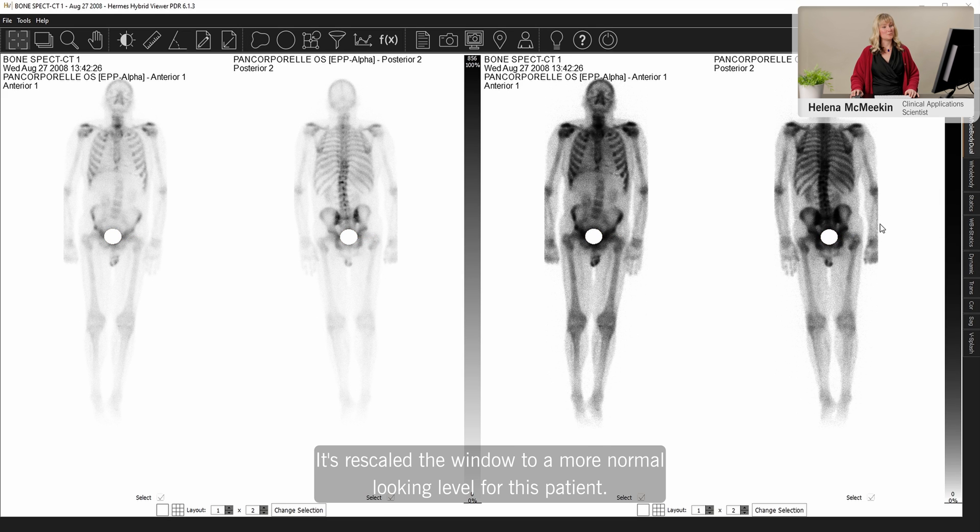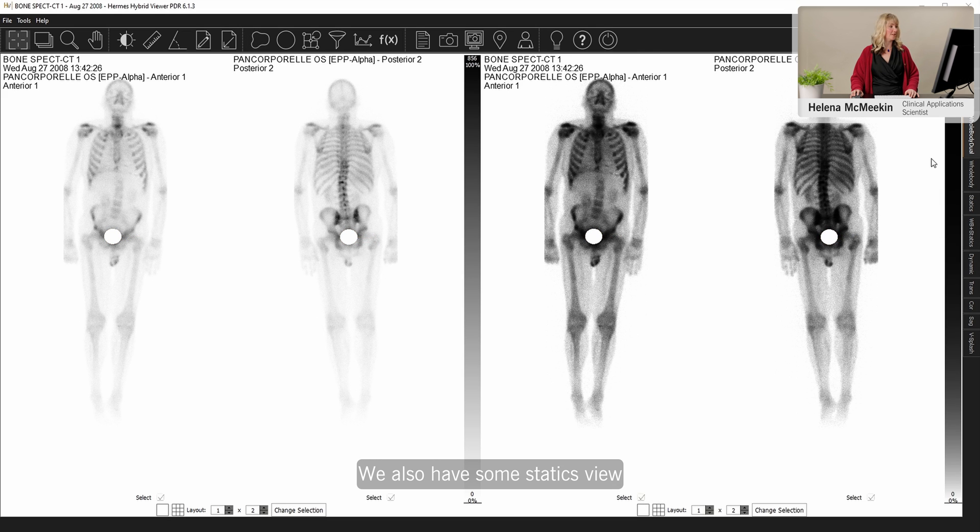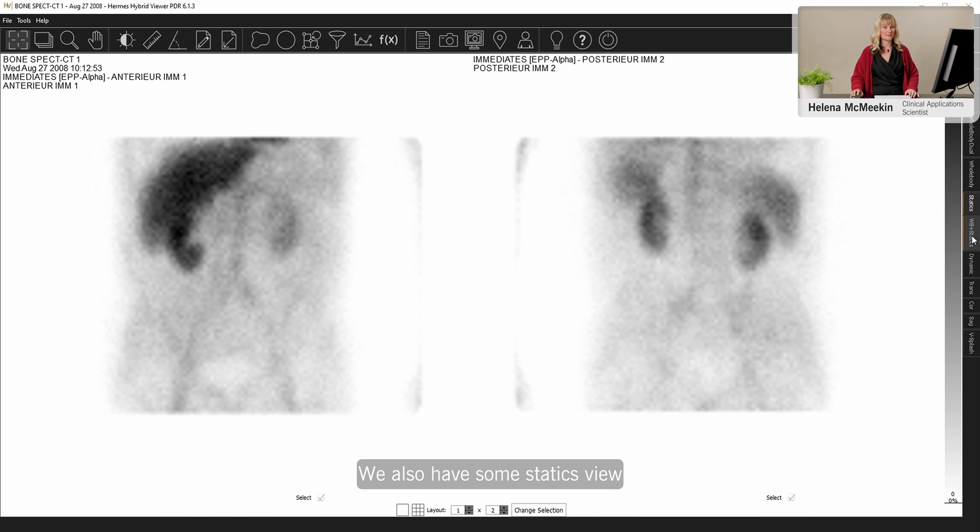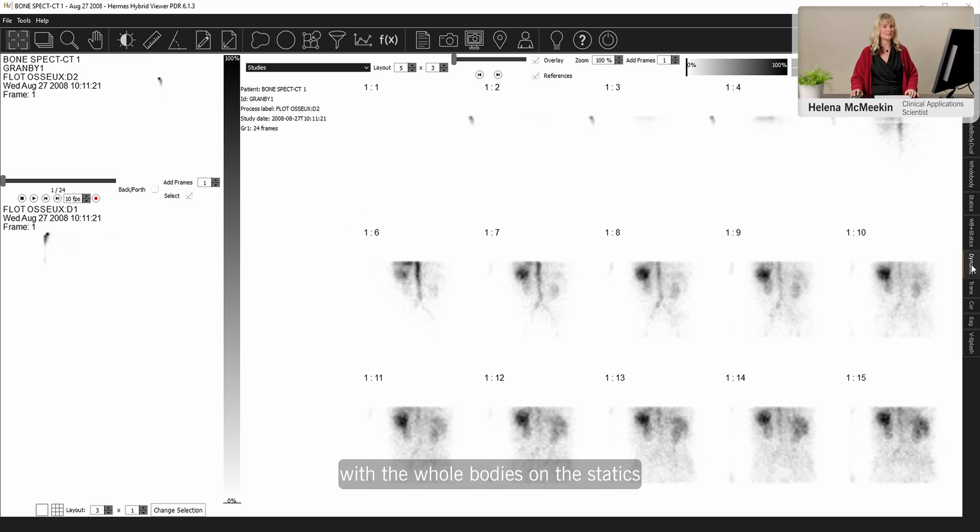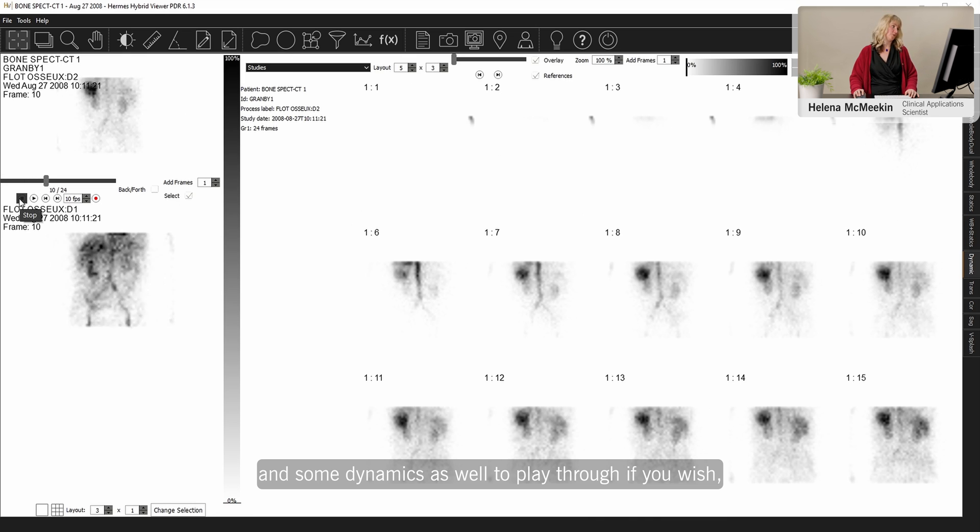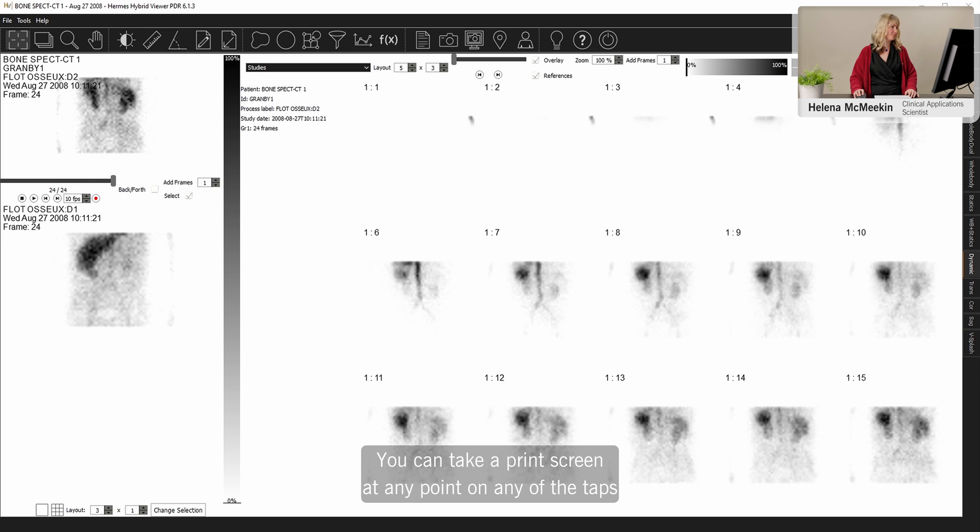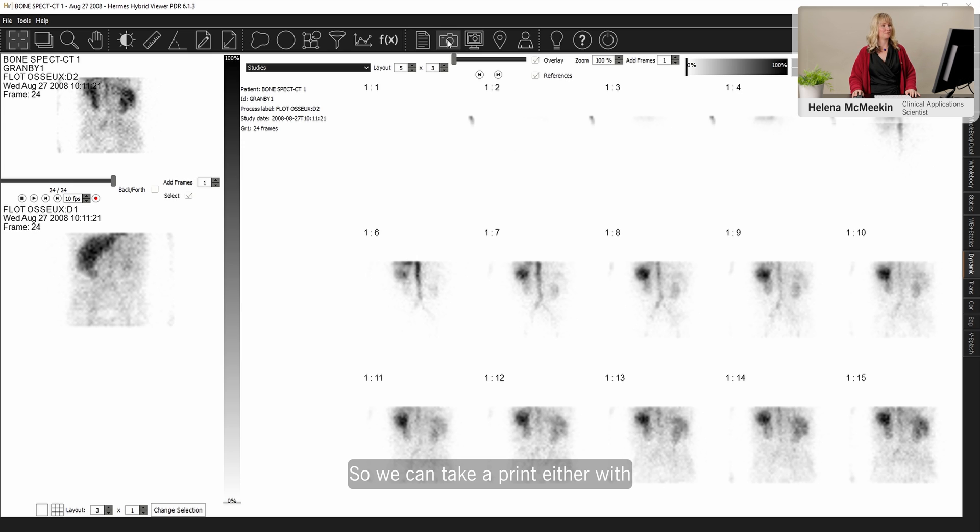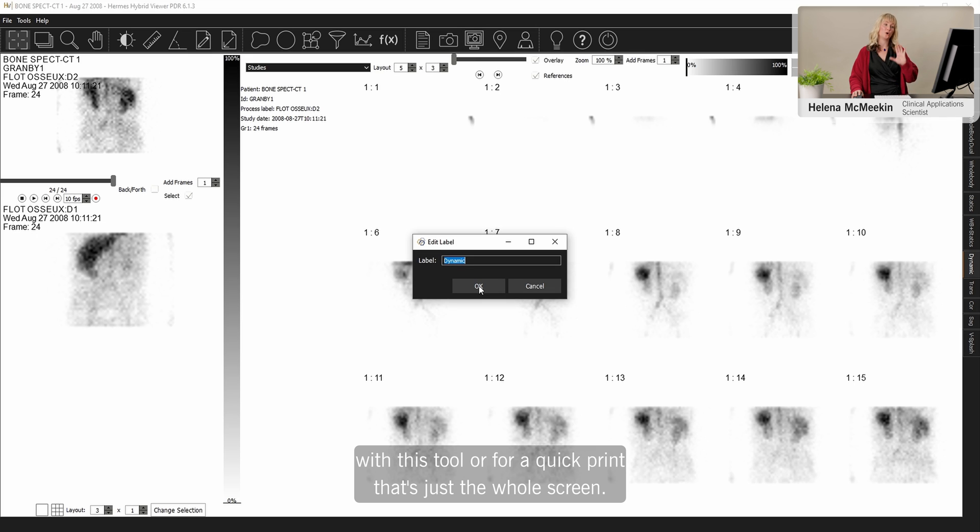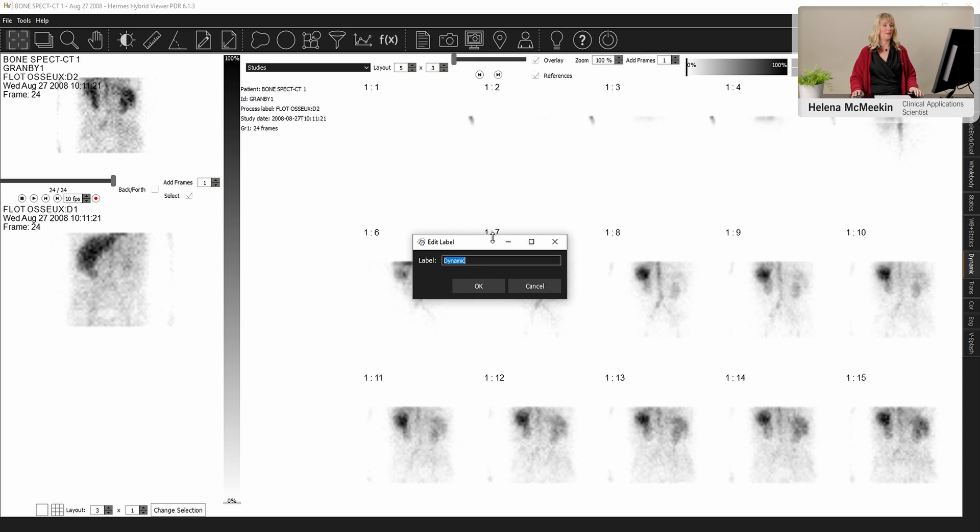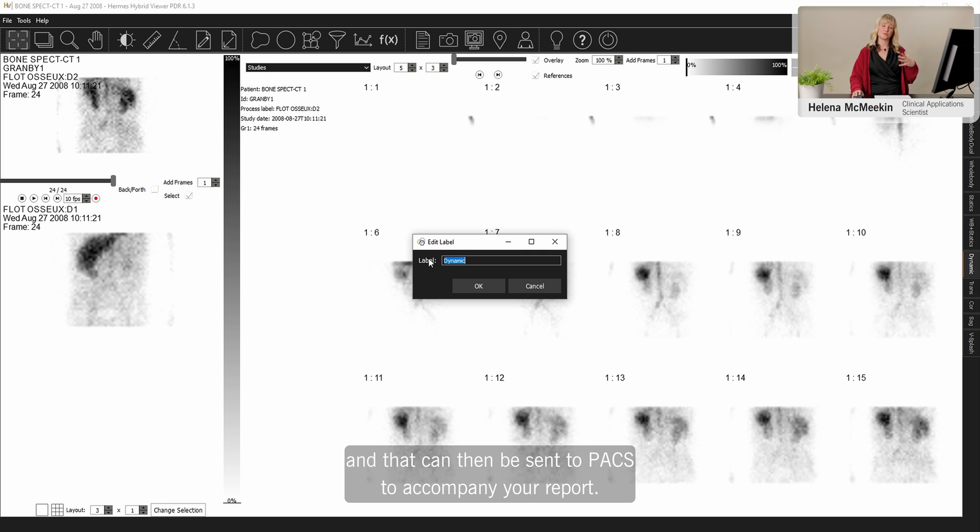For this patient, we also have some statics, a view with the whole bodies and the statics, and some dynamics as well to play through, if you wish. You can take a print screen at any point or on any of the tabs. So we could take a print either with this tool or for a quick print. That's just the whole screen. And then you can save it with a name. And that can present to the PACS to accompany your report.